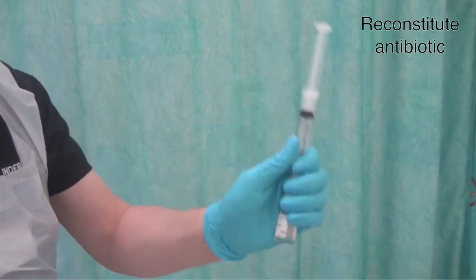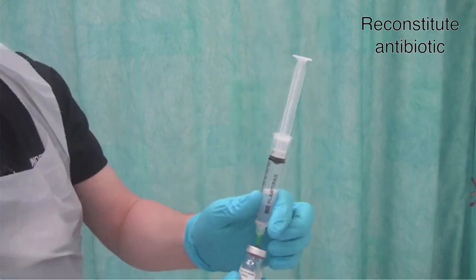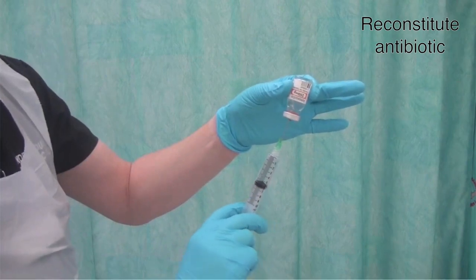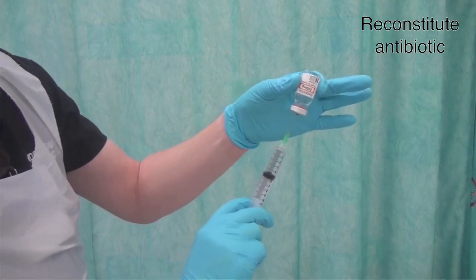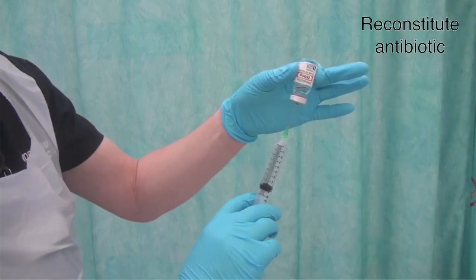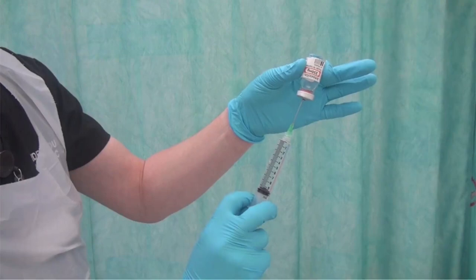Hold the syringe firmly in place and shake the vial until the antibiotic is dissolved. Turn the vial upside down and inject the air back in, which puts the vial under a positive pressure. Bring your needle back so that it's only just in the vial, then release the plunger so that the syringe fills itself before aspirating back as you withdraw the needle.